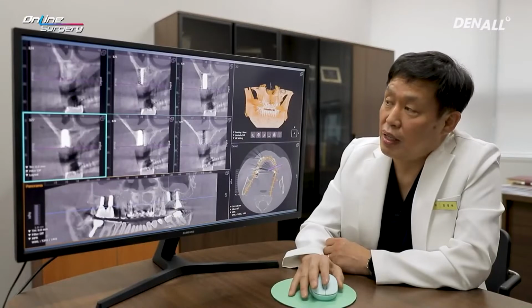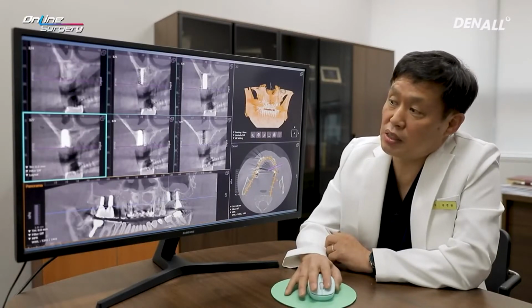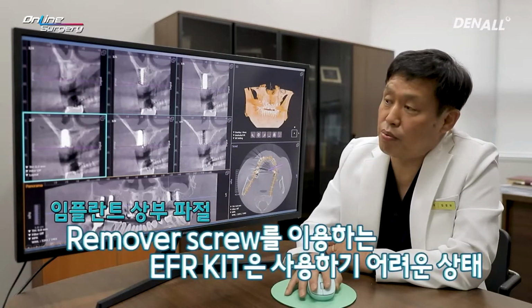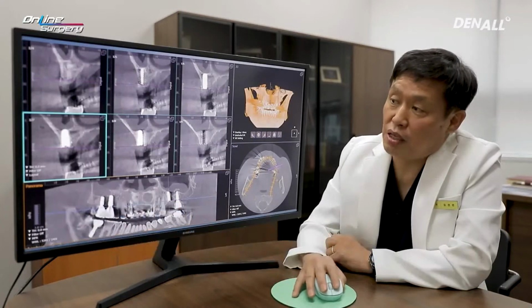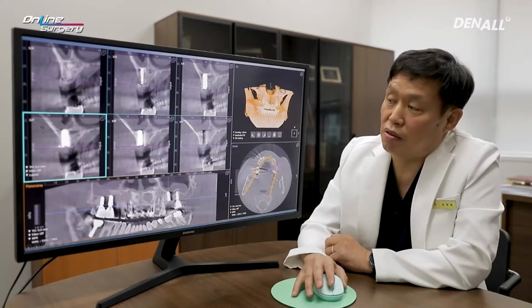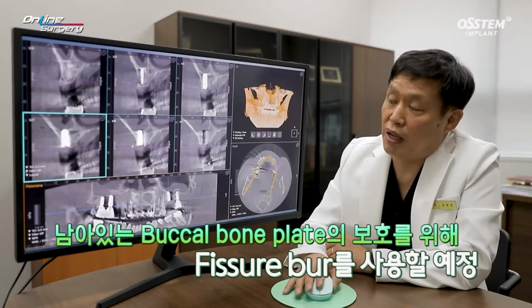If the implant is fully osseointegrated as shown in the case, and if the superstructure is fully fractured, it is difficult to use the EFR kit. If you use a trephine burr here, the buccal plate will be destroyed. Therefore, in order to preserve it, in my case, as I've mentioned earlier, I use a fissure burr in high speed to make a slight gap, gain fulcrum, and use an elevator to luxate the implant for removal.